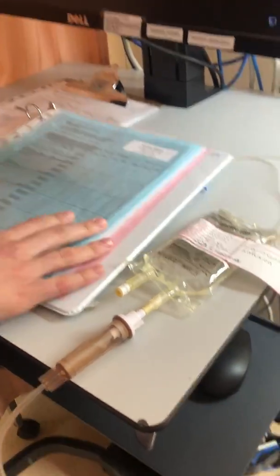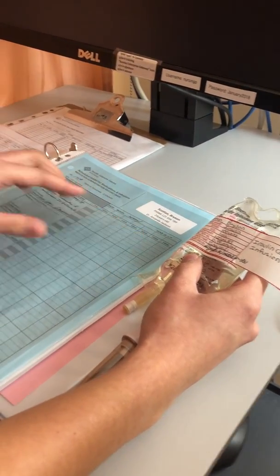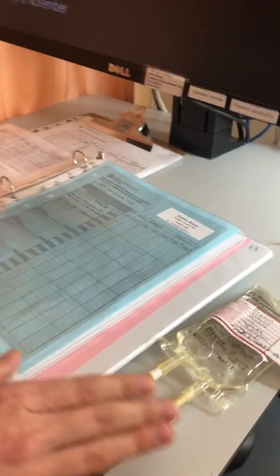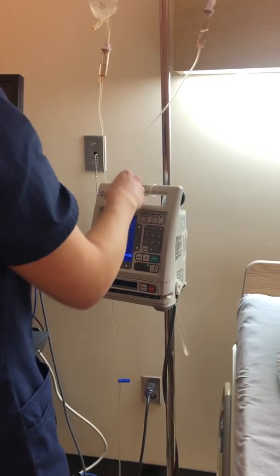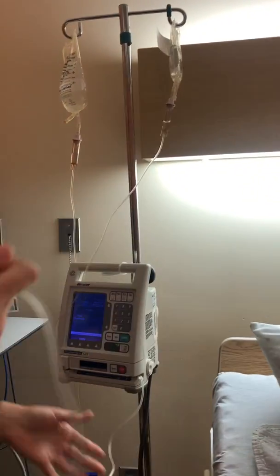Then I'm just going to check with the MAR now. So I've done right patient, Bryson Scotland. Okay, and we've done this one already, so that's the end of the first check. So I'm going to hang this up here now. I'm just going to check that the correct tubing was used with no ports, and it is.